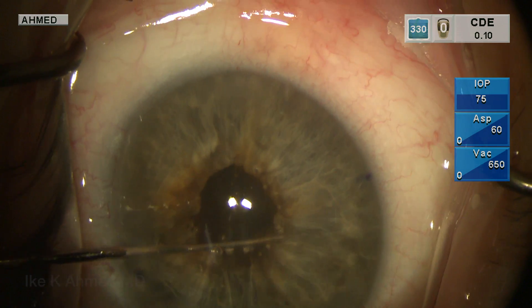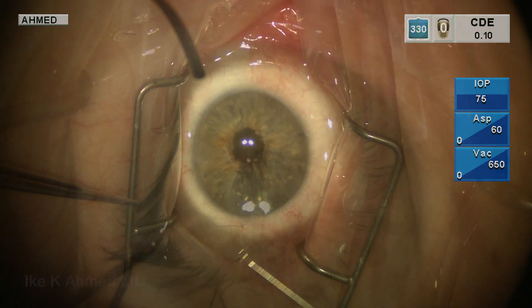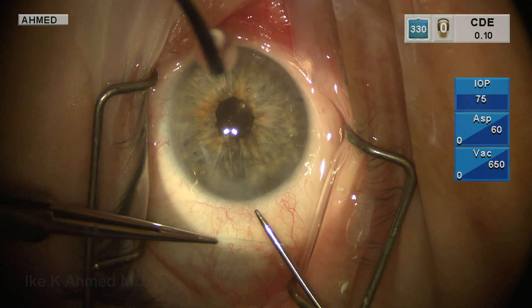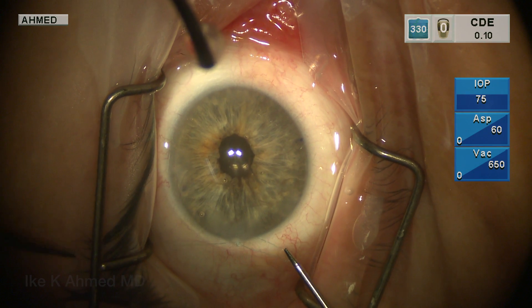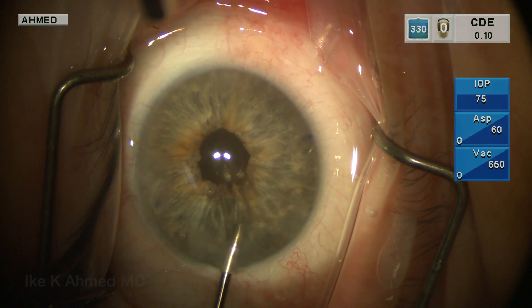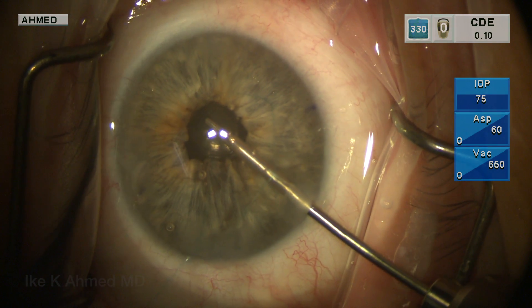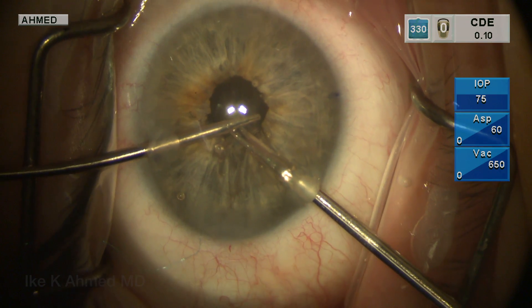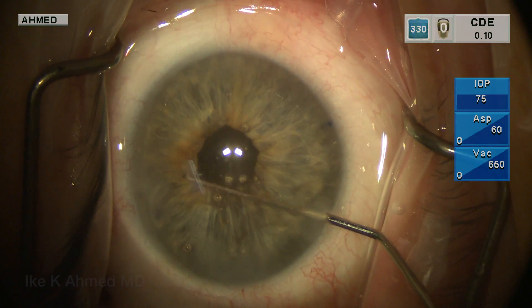Our goal here is basically to match this patient's fellow eye, which is approximately just between three to three and a half millimeters — this is the usual size. We will then lock the knot with a backhand throw here. And again, rather than the suture coming out to the incision, we're passing the knot into the eye with the aid of a micro-grasper. This is certainly a helpful technique as an alternative to the Siepser sliding knot or the complete intraocular tying, and we feel this is a very straightforward technique to use.